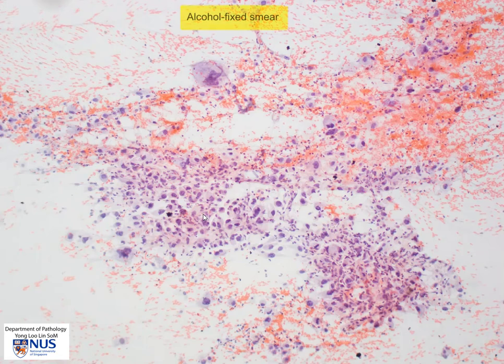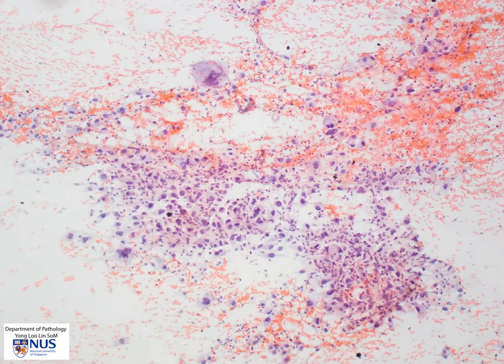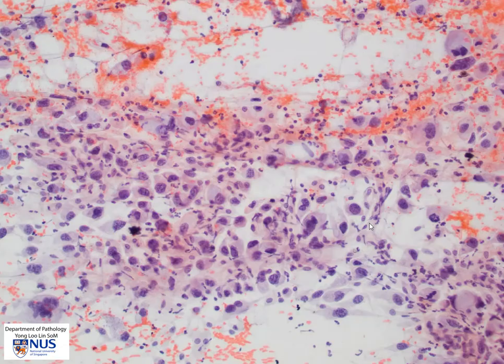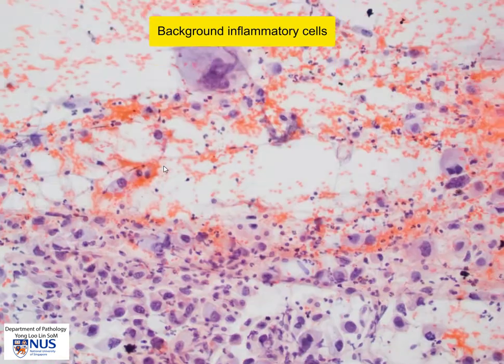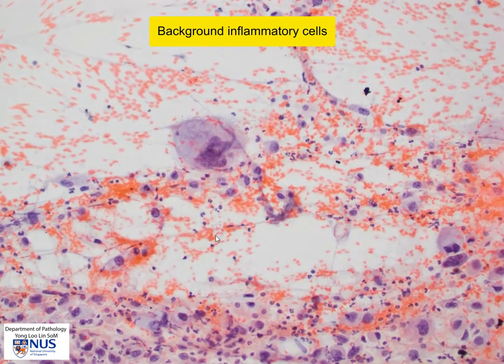Here is the alcohol fixed smear and we can see again these very large fairly dispersed cells. We're not seeing any papillary formations or any micro follicular structures, and there are also huge bizarre malignant cells. Again in this particular smear we can see quite a lot of small inflammatory cells in the background in between the malignant cells.